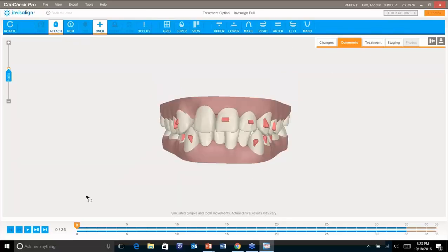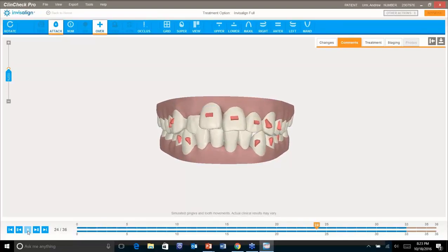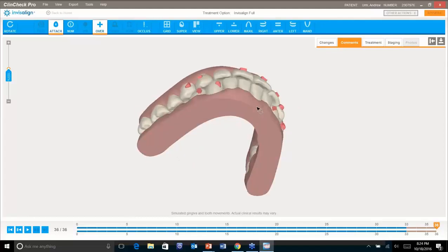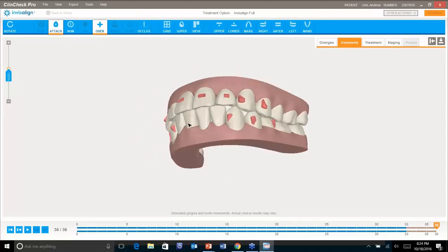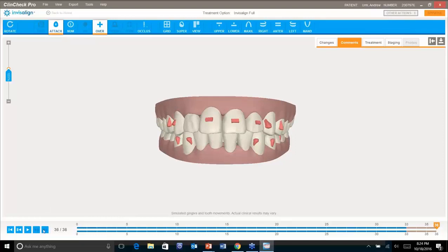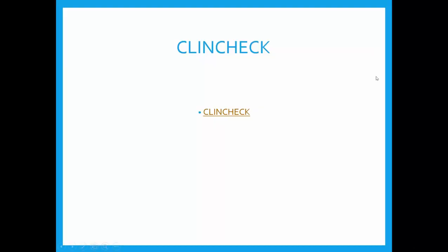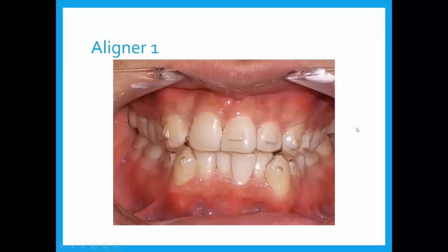We've got a result that shows full resolution of the malocclusion — proper arch form, proper arch width, nice buccal-lingual inclination, an overbite, an overjet, canine-guided and protected occlusion, and intercuspation without interference. We could tell you the patient was very compliant because Invisalign clear aligner therapy works well if it's in the mouth. Here's the lower 33rd aligner in a very nice arch form, all teeth lined up, with the crossbite of number seven corrected and a class one occlusion with posterior intercuspation without interference.